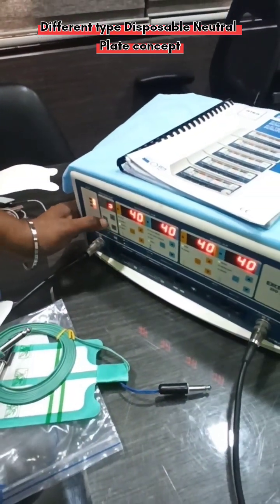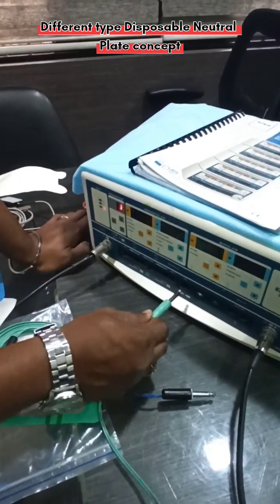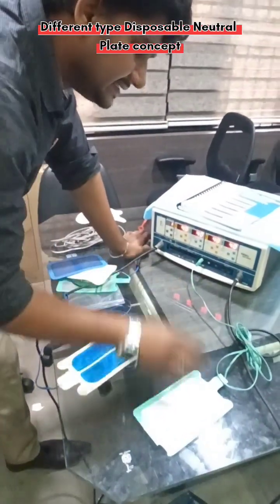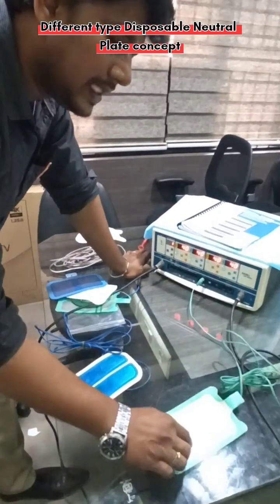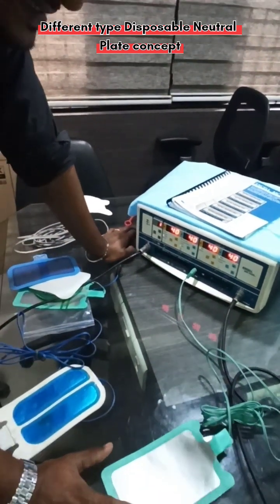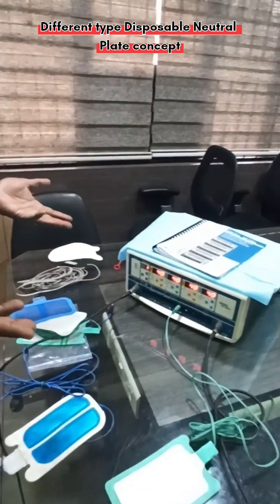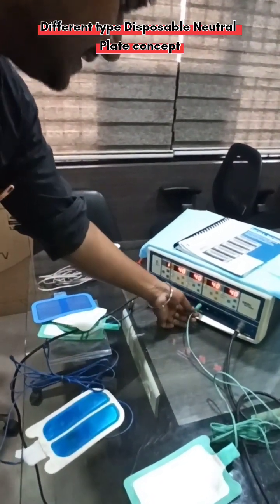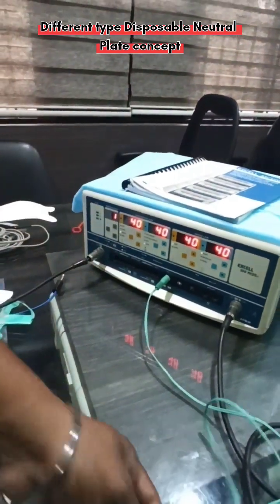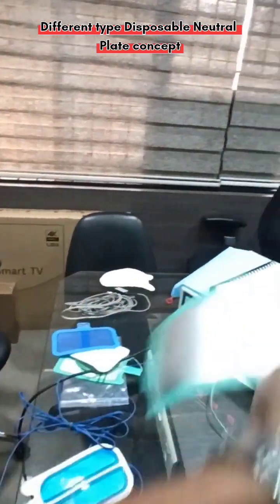When I switch on the machine from standby mode, you can see it shows 'No NP' — that means no neutral plate. Now I am going to fix this earth plate. Once I fix the single-section earth plate, you can see the machine automatically stops the error — whether or not it is actually connected to the patient. So even if connected only to the machine and not to the patient, it won't give any alarm.